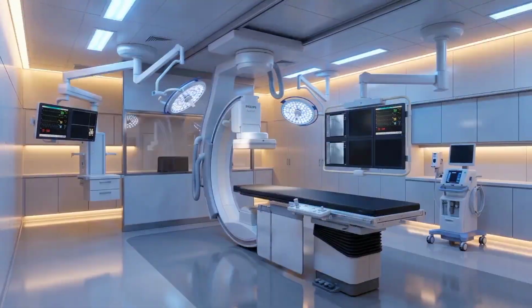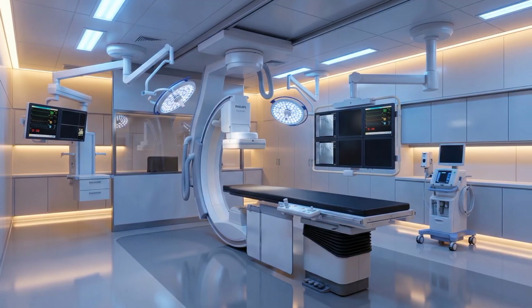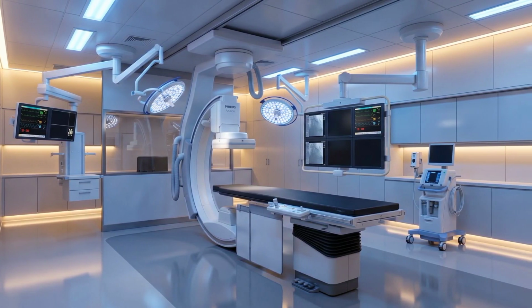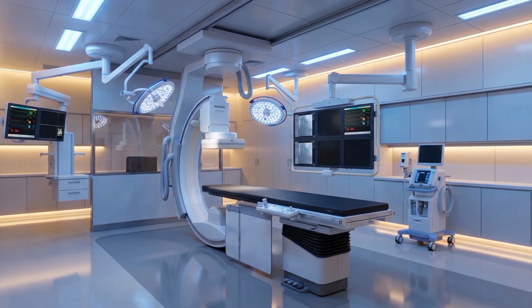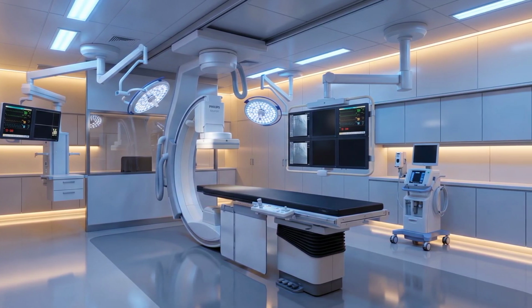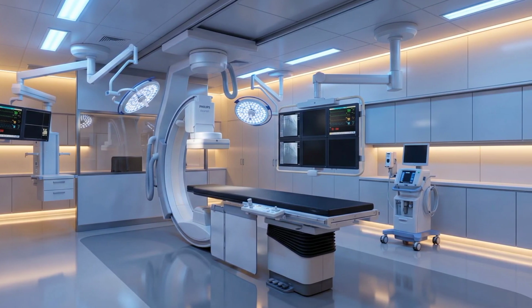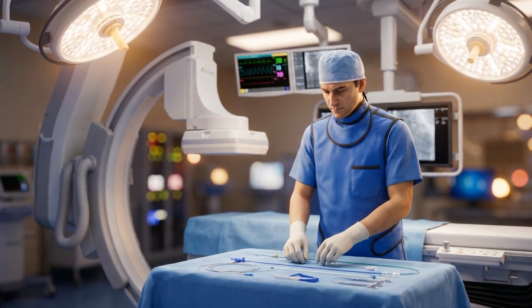Instead of open heart surgery, doctors can access the heart or blood vessels using thin tubes called catheters. Now imagine entering a cath lab. At the center, you will see a patient lying on a procedure table. Above and around the patient, there is a large machine called a C-arm. See in that image, there is a C-shaped machine. That is called a C-arm. This is an X-ray imaging system that can move around the patient and capture real-time images from different angles.